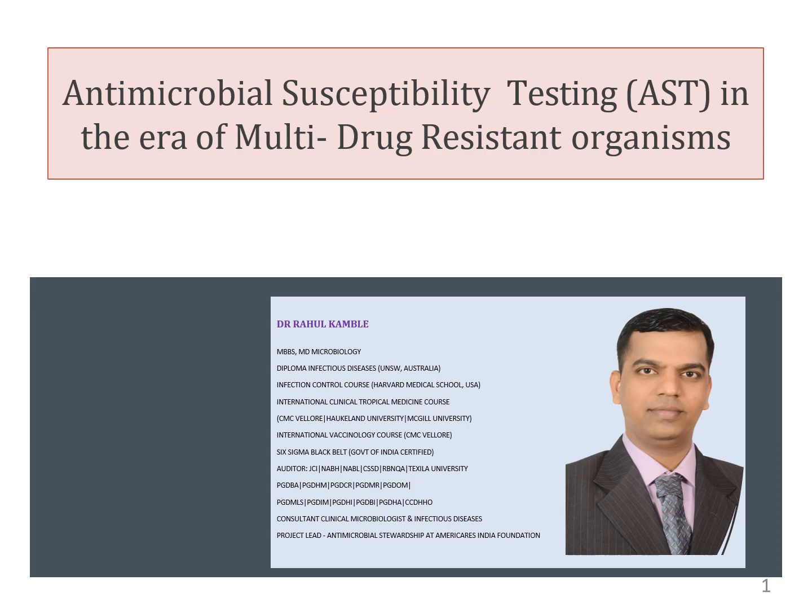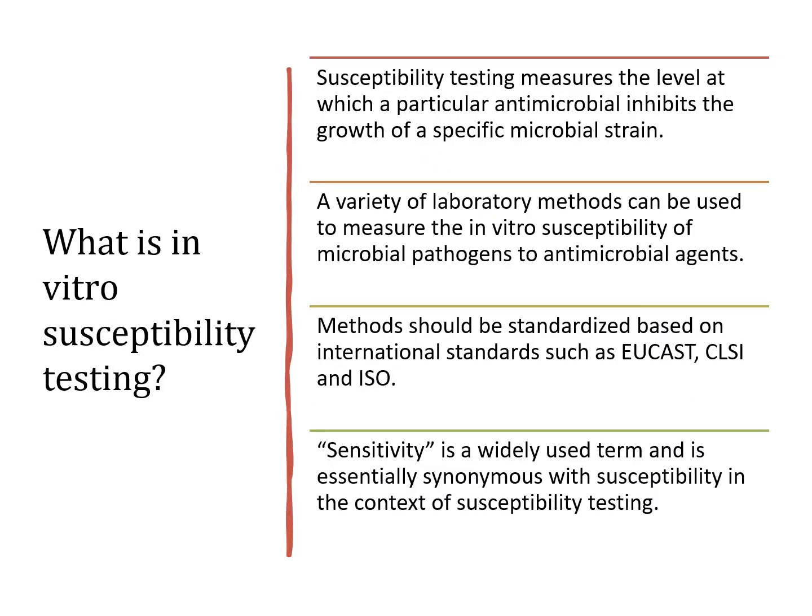Hello, let's understand how to interpret antimicrobial testing in the area of multi-drug resistant organisms. What is in vitro susceptibility testing? Susceptibility testing measures the level at which a particular antimicrobial inhibits the growth of a specific microbial strain.